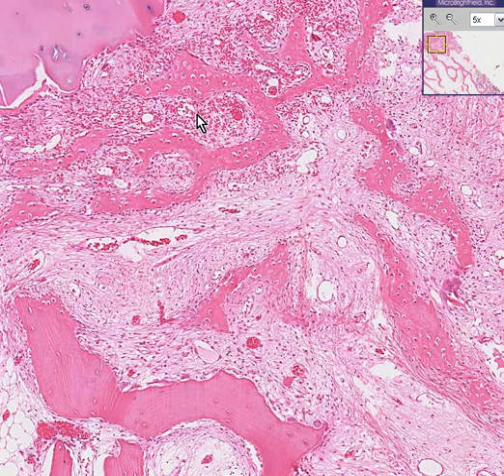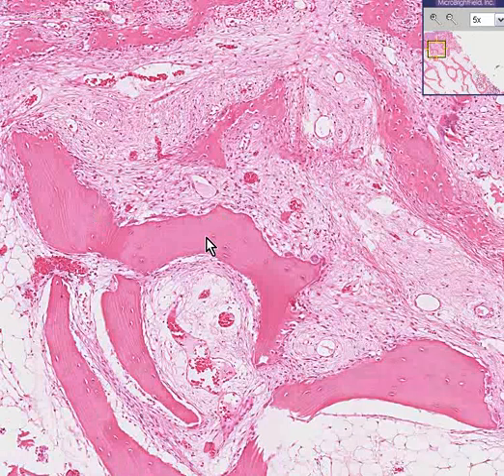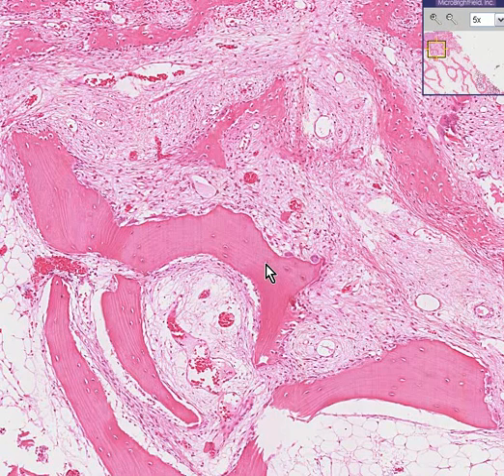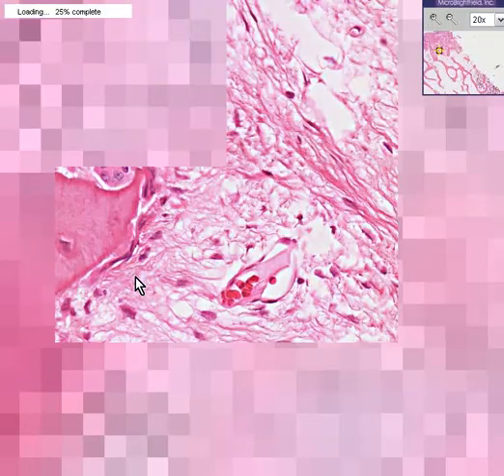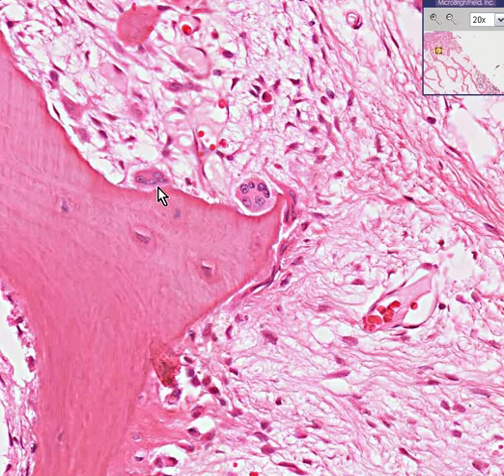These are probably newer spicules because they still have a lot of osteoblasts turning into osteocytes, whereas up here the spicules are a little more organized. This is the bone of hyperparathyroidism because we found more osteoclasts than there should be. Here's probably a couple over here too. Let's take a look. Sure enough, these osteoclasts are even nicer than the other ones we saw. They're beautiful. Thank you very much.